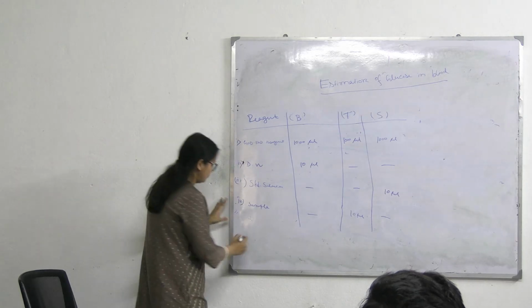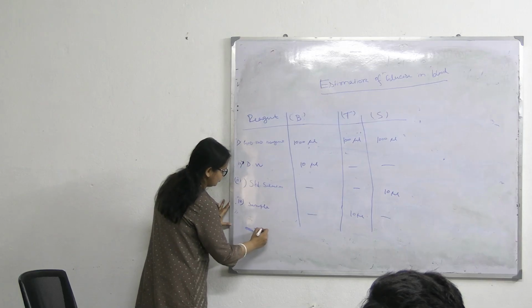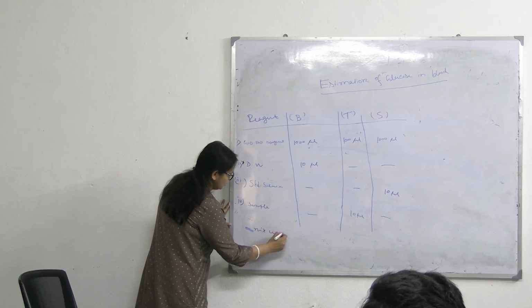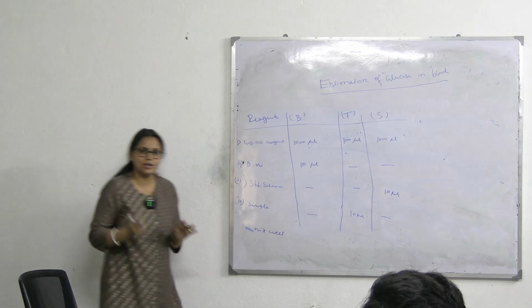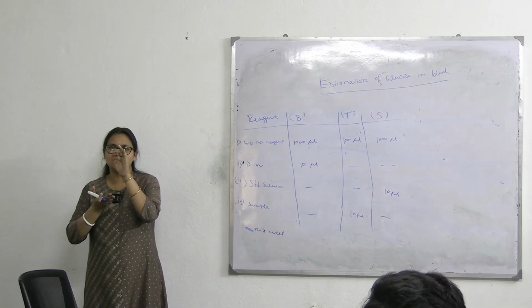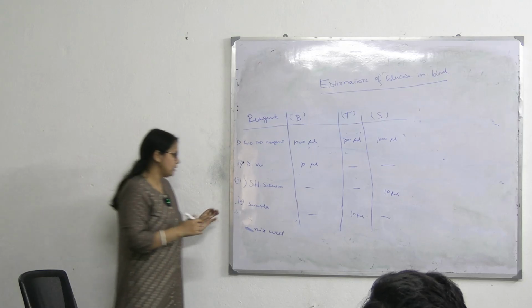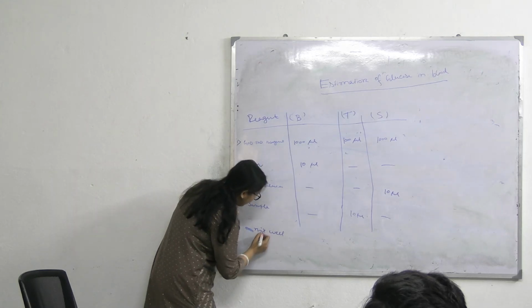So you have to mix well. After adding both things you have to mix well. কেন মিক্স করতে বলছি, অনেকে কি করে জাস্ট অ্যাডিং দ্য ব্লাড স্যাম্পল অ্যান্ড ইউ আর ওয়েটিং, নিচেরটা রিয়াকশন স্টার্ট হয় না, তো ফুললি কালার ডেভেলপ ইজ নট প্রেজেন্ট, সো রেজাল্ট উইল বি ভ্যারিড. সো ইউ হ্যাভ টু মিক্স ওয়েল.